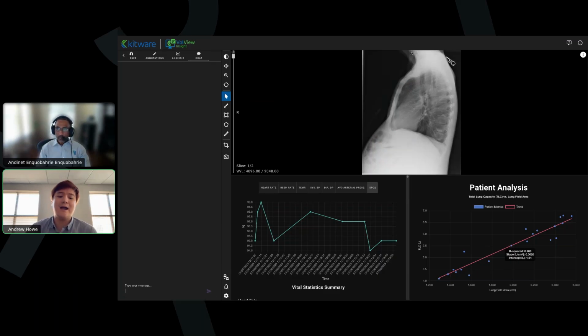For instance, I can't just drag and drop my clinical data to ChatGPT because I would have to export the FHIR resources, and there are probably already a lot of security issues with that. But it's also really difficult and unwieldy. So what we have here is a system where we take in the FHIR resources, which represent the constraints of connecting with an EHR, and we send it to the backend.